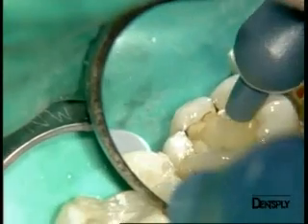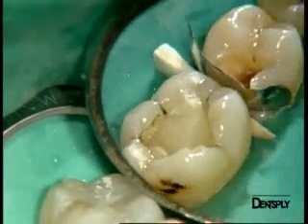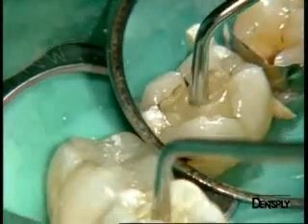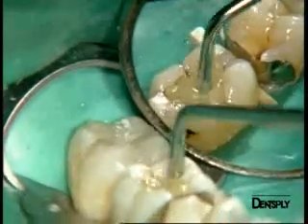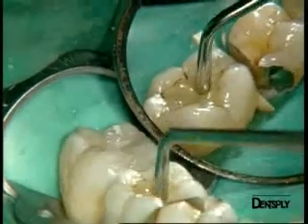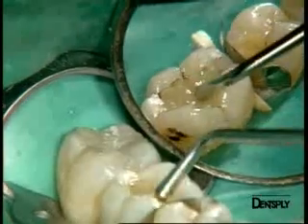We can fill it all with one mass of material. The condenser helps make the material slightly more fluid. We obtain a homogeneous mass of composite on which we directly shape the all-important anatomical structures of the occlusal surface.